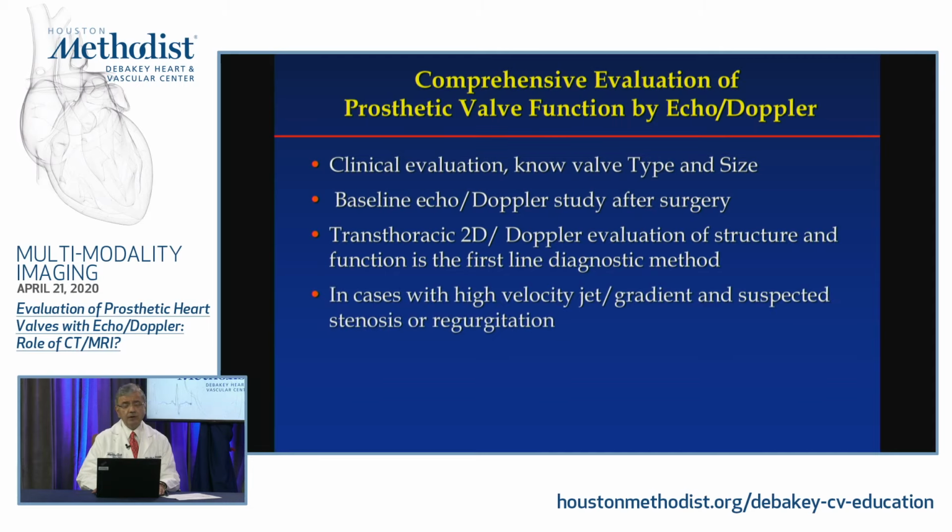In cases where you have high velocity jet gradient and suspected stenosis or regurgitation, you have to do a few things. One, compare to previous studies, and I think that's going to be very important. Nowadays, in the digital era, it is easier than it used to be before.